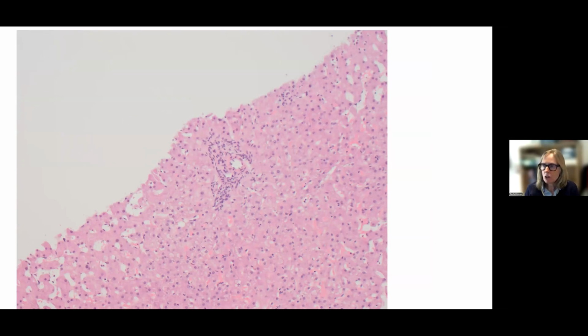So let's have a look at those in a little more detail. We've got something here that includes fibrous tissue. There's an artery here. And there is some biliary epithelium present around the periphery of this structure, so maybe ductules. What we look for in a portal tract would be the pairing of an artery and bile duct. And the duct itself would be close to and a similar size to the artery and usually quite rounded. There may be a duct there. It's hard to say for certain.